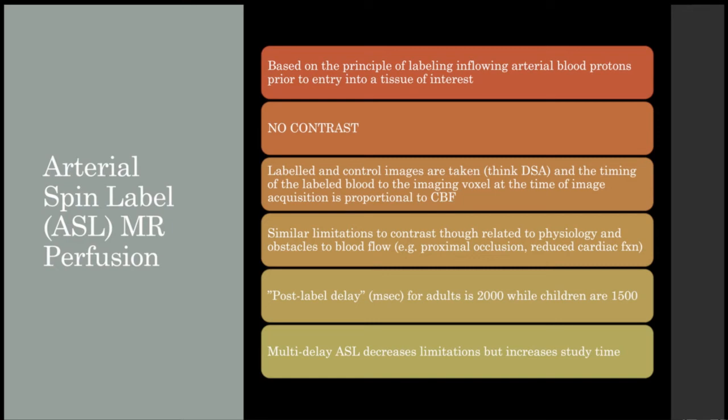That's the one thing that you're still kind of working on. But if you realize that radiation is not an issue, your main limitation is scanner time. So if you miss it, you could always go back and do it again if the patient is calm, and you're not exposing them to more radiation. So there are definitely some pluses. There's a multi-delay, which is very similar to multi-phase CTA, which we use for our stroke protocols. But again, study time and scanner time is the issue. We've got 5 scanners in the hospital right now, so we're a little bit more open to more scans as long as we can communicate that with our radiology and our radiology techs.